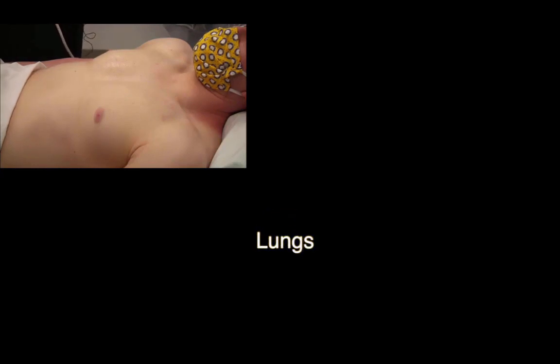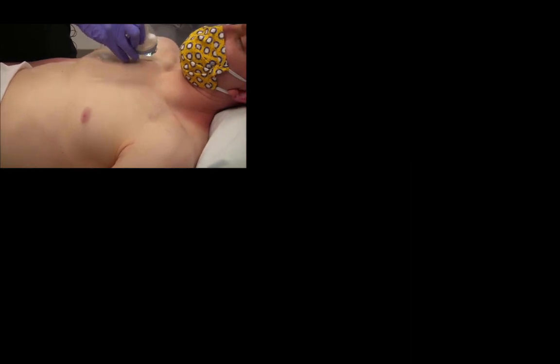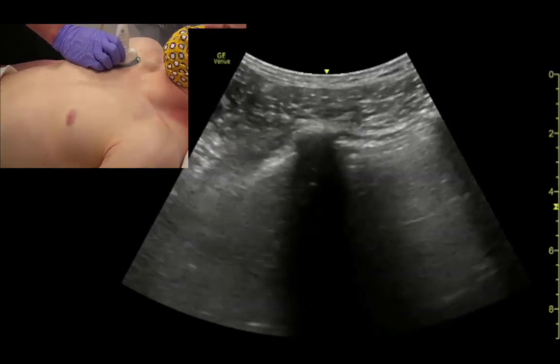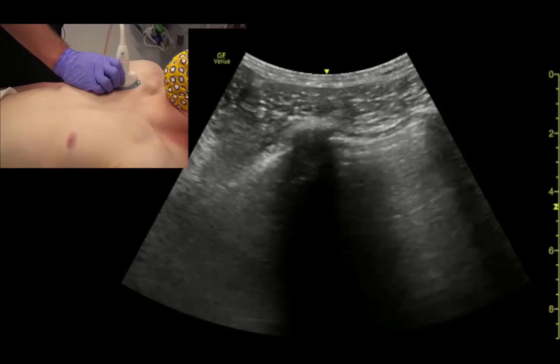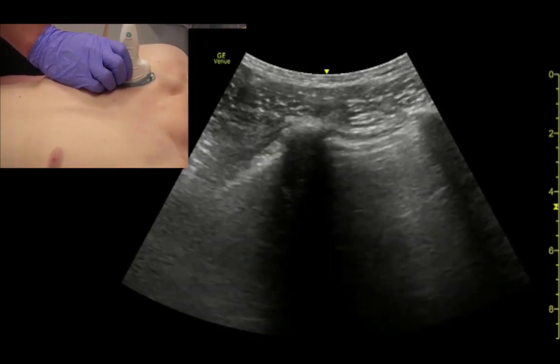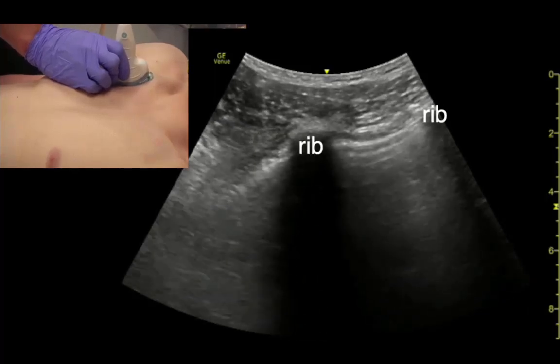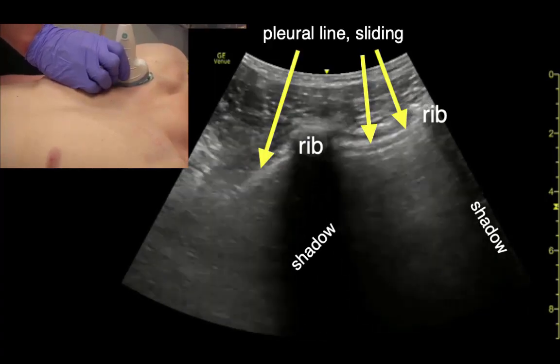All right, so next up we're going to just take a look at the lungs with the curvilinear transducer. Sometimes in a clinical environment I like this because it just shows me more territory more efficiently. We're still going to start roughly the same place, maybe up a little high. And what we want to do when we're examining the lungs for things like pneumothorax or effusions or consolidations. Midclavicular, indicator towards the head. We identify ribs and then pleural sliding.